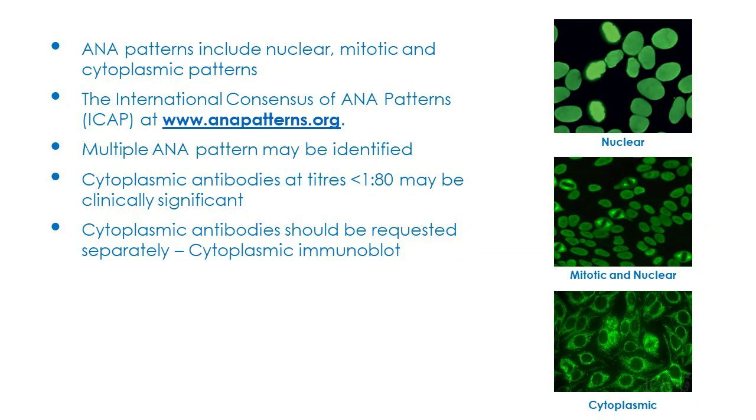ANA patterns include nuclear, mitotic, and cytoplasmic patterns. I would like to refer you to ICAP, the International Consensus of ANA Patterns, at www.anapatterns.org. Their aim is to standardize reporting of ANA. The website includes all ANA patterns with disease associations. Please note that more than one ANA pattern may be identified. It is up to each laboratory to evaluate their competency in identifying patterns.